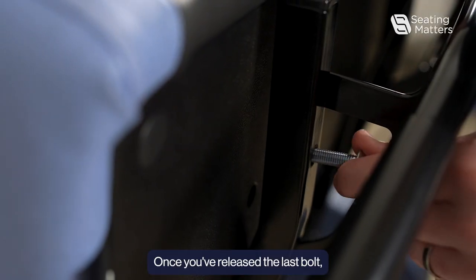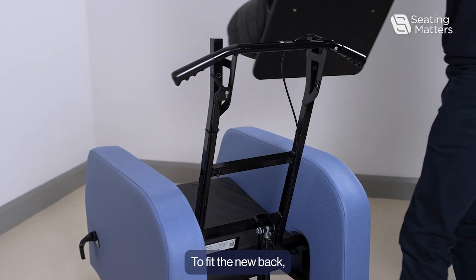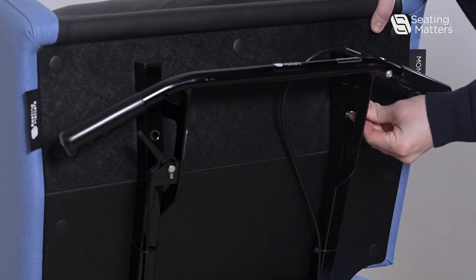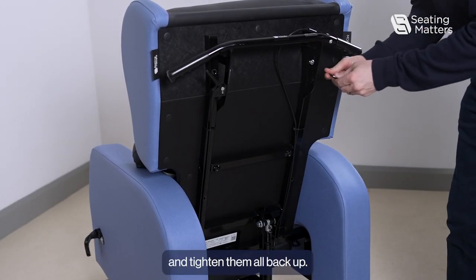Once you've released the last bolt, the back can then be removed. To fit the new back, we just put it back into place and align the holes using the bolts and tighten them all back up.